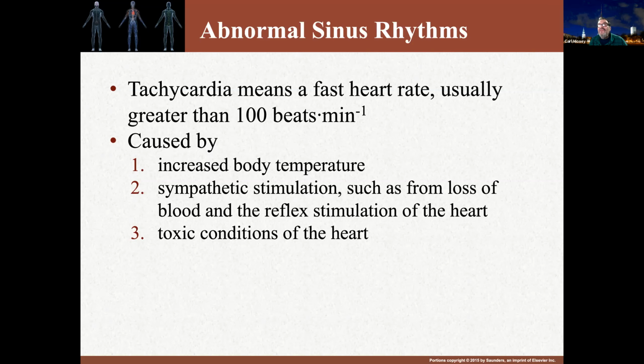Our first condition will be sinus tachycardia. Tachycardia is a condition where the heart rate is higher than normal.